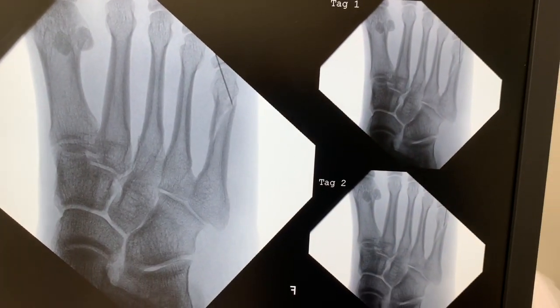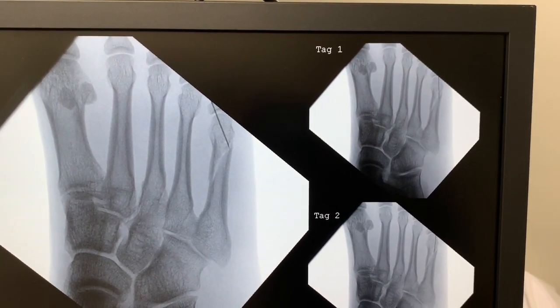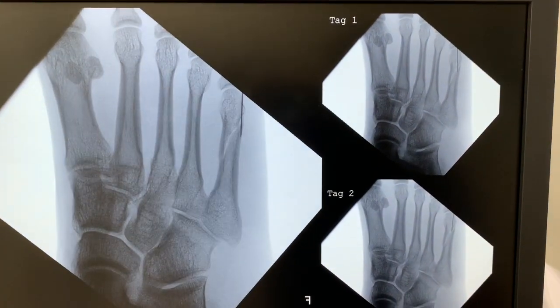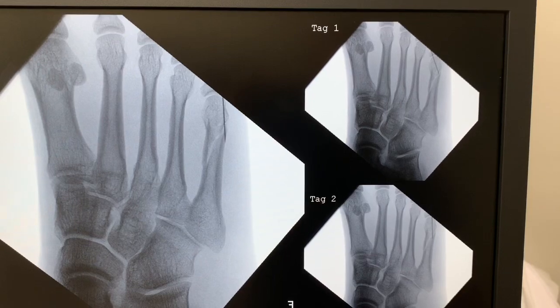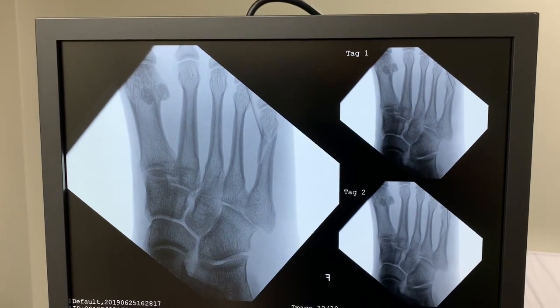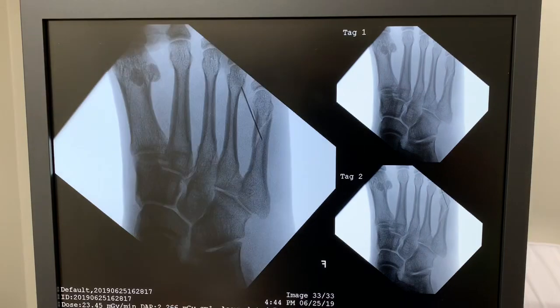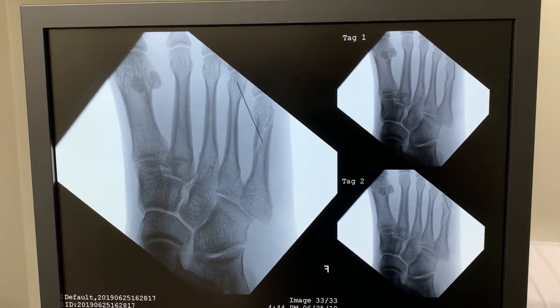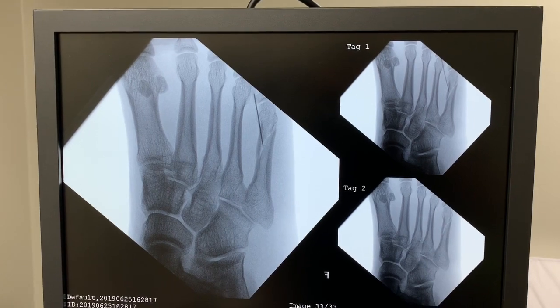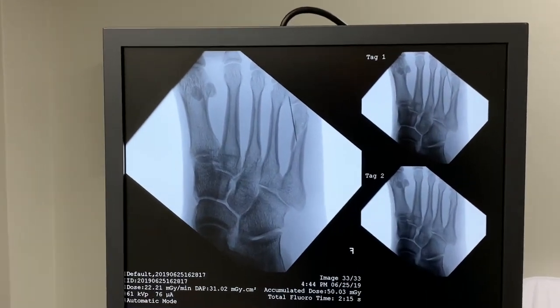How about now? It hurts but it's not something I can't handle right now. Okay, let me know if you want me to stop, please — absolutely. So now what I'm going to do is brush it right in. It's crunchy. Here we go.